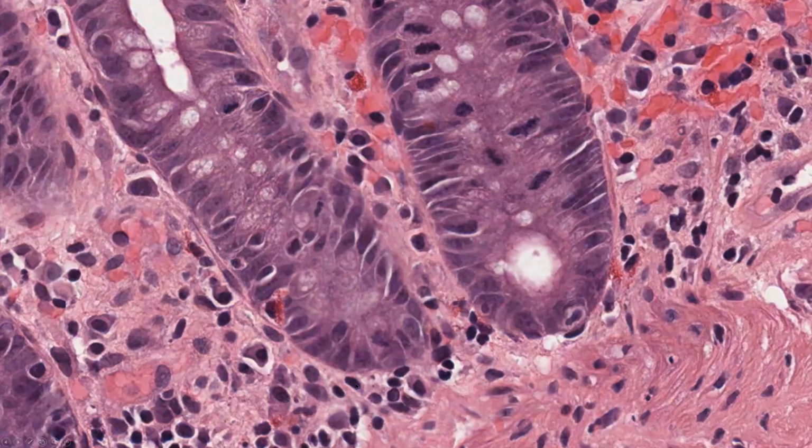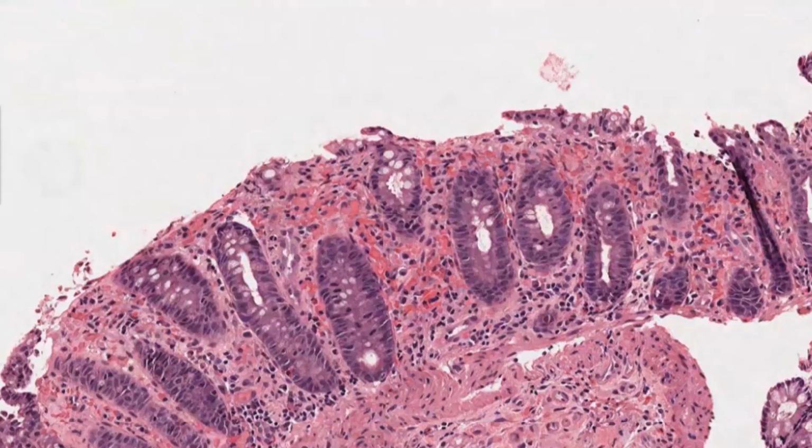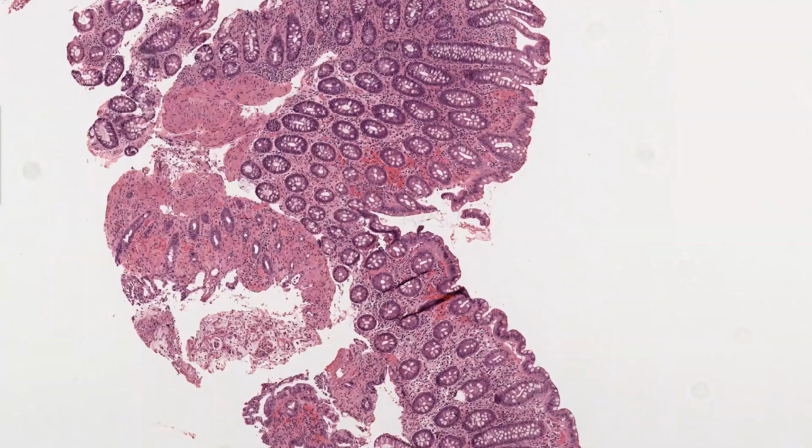They are not trying to cluster, and they are not trying to behave in any different way, except the fact that there is definitely a significant red blood extravasation there. Here and there, and here are the other areas at the bottom of the low power that I wanted you to see with me at a higher power.